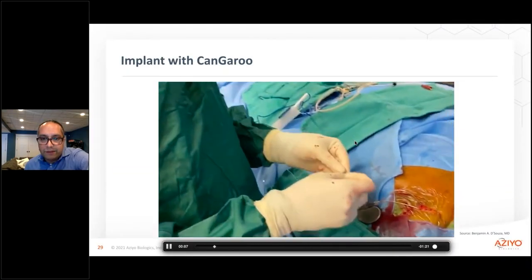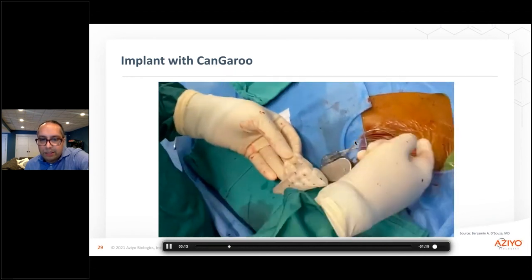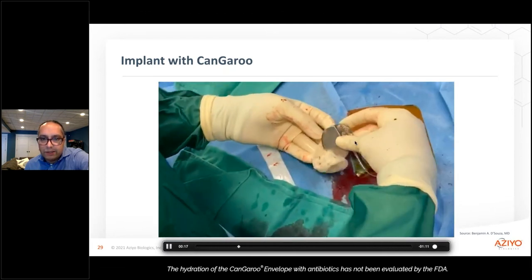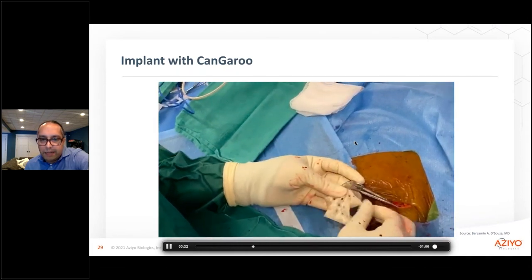So this is the actual implant itself. For those of you who have never actually felt a kangaroo pouch, I would recommend you do — certainly after it's soaked in either saline or antibiotic. I tend to use the antibiotic wash that we use to wash the pocket. The feeling is particularly different as opposed to a synthetic pouch.